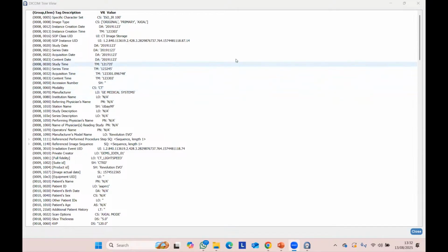As I already mentioned, the DICOM information is standardized by many international bodies, but sometimes the vendors make their own DICOM info. It is the problem.